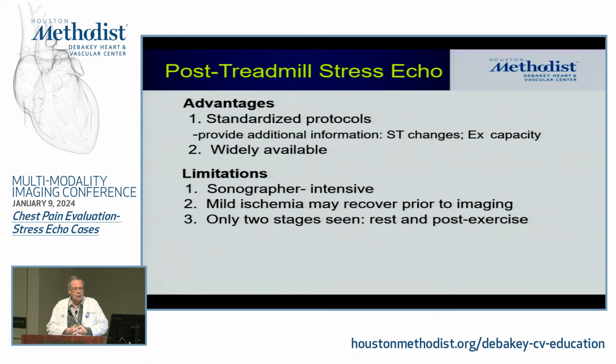So this is not where you start your rookie sonographer on the first day of class. This is something that requires sonographers that have gained some experience already with LV assessment, with regional wall motion. Usually it's better to start them first with either dobutamine or bike, which are a little bit more relaxed, and move towards treadmill rather than throw them in the treadmill lab on the first day, because it is more intensive, no question about it.